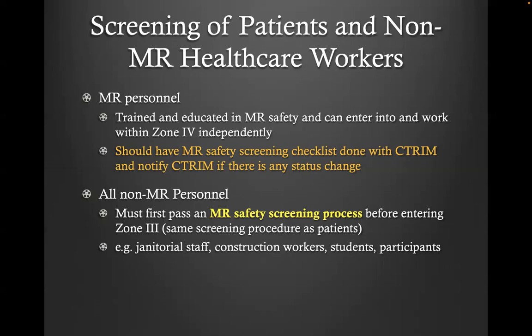And all non-MRI personnel, which includes all your subjects and any visiting students or scholars that you bring to the MRI suite, must first pass an MRI safety screening process before they can enter Zone 3. It's the same screening procedure as for patients. The same applies to janitorial staff, construction workers, and people around here. If you bring anybody else, then you as the MRI personnel will be fully aware of safety, and you should advocate for MRI safety. You are the advocate of MRI safety, and you need to be responsible for the MRI safety of any person that you bring to the imaging floor.